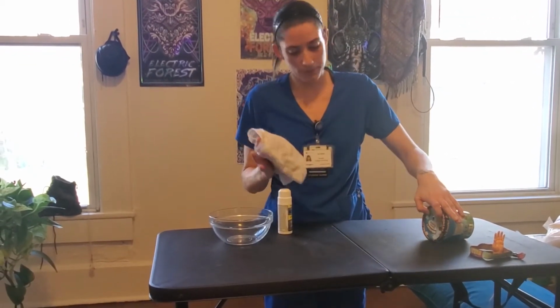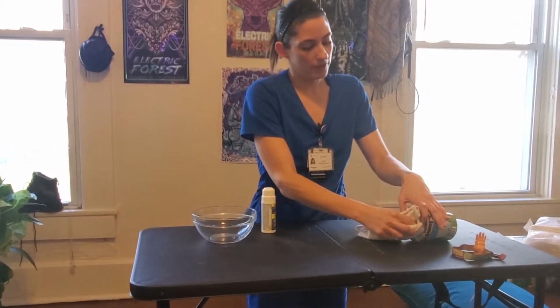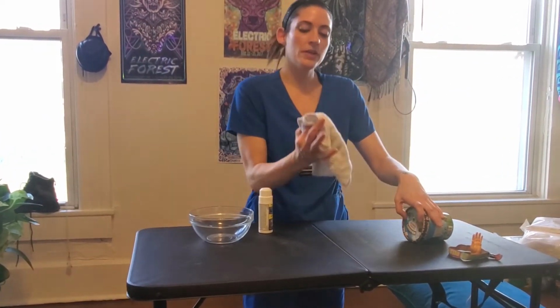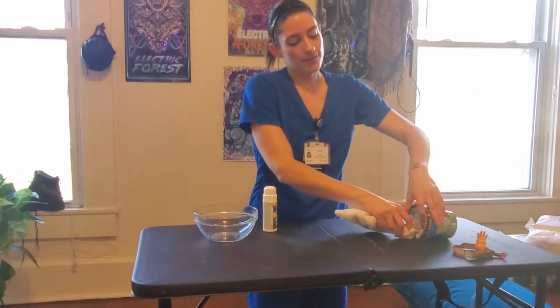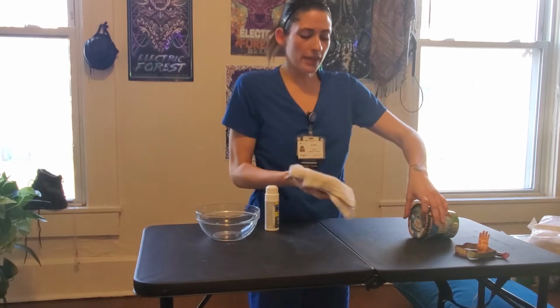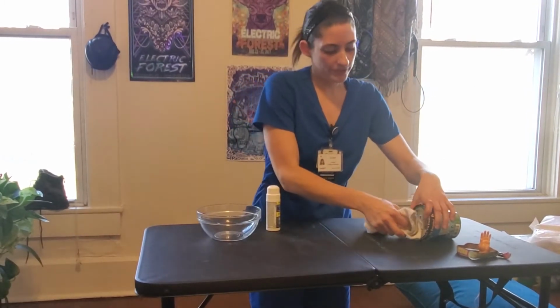I'm going to separate the labia. We're going to clean from the top to the bottom on the side of the labia farthest from me. Switch to a new side of the towel, clean from the top to the bottom on the side of the labia closest to me. And then we're going to clean from the top to the bottom, switching side of the towel, down the center of the urethra.